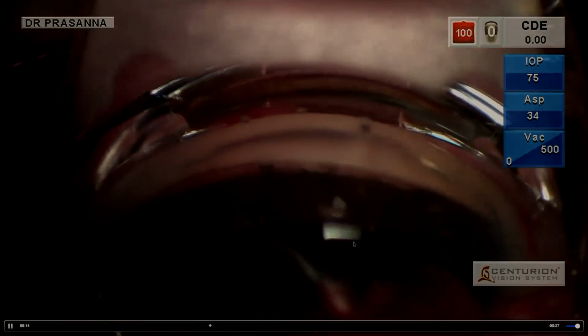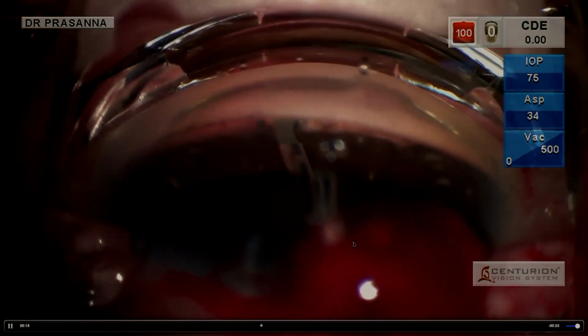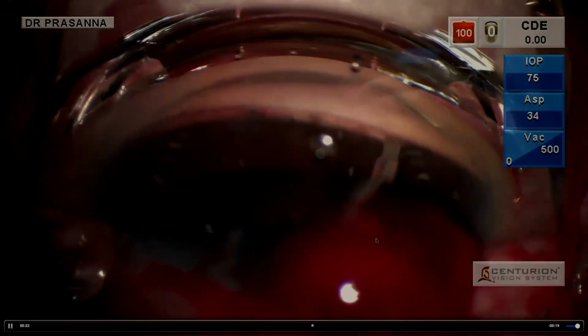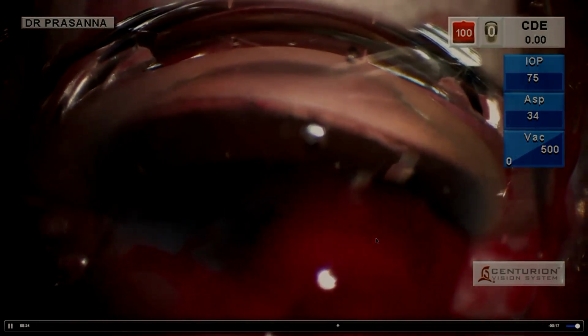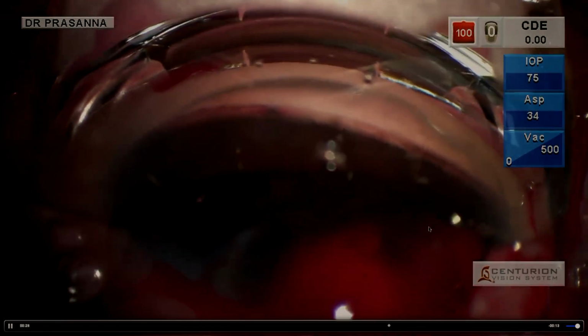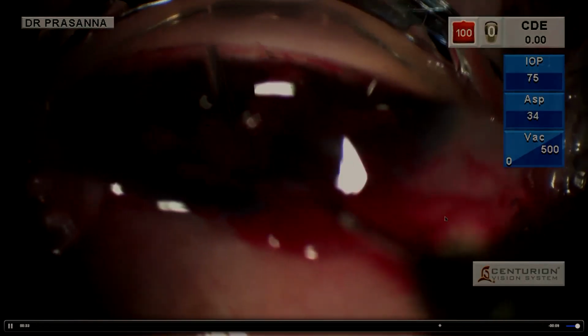As Mohiddin sir was showing in his video, where he used a Tanito hook to press down the root of iris, the same thing can be done with the KDB as well. Once you are in the right plane, opening up the trabecular meshwork can also cause the root of the iris to fall back in cases where the root of iris is at the level of pigmented trabecular meshwork. So it really works well.